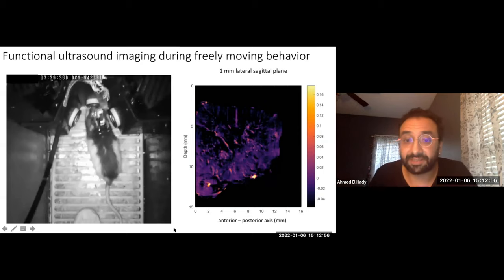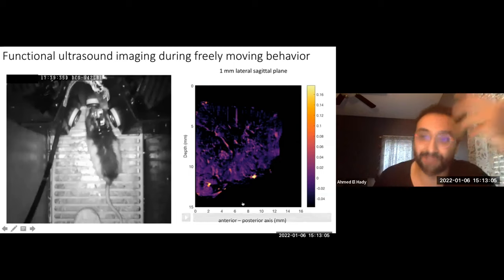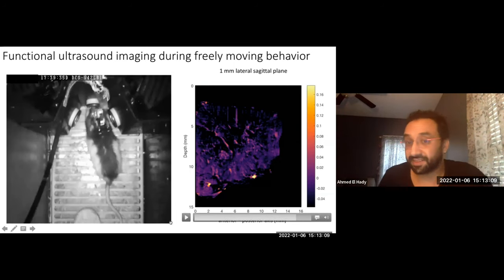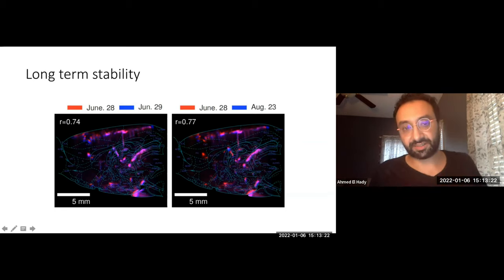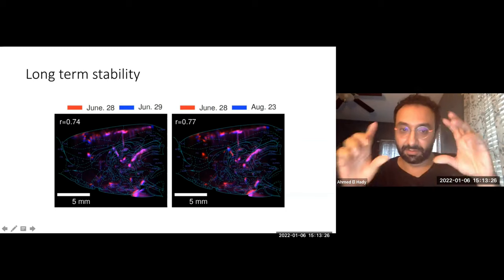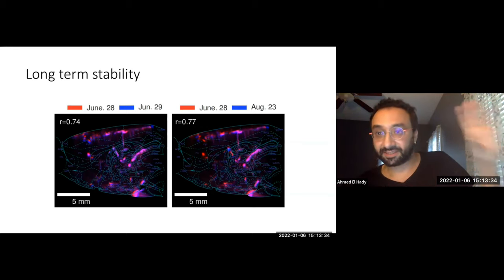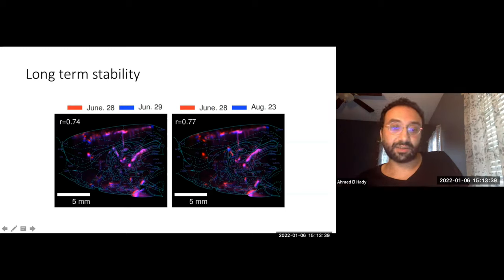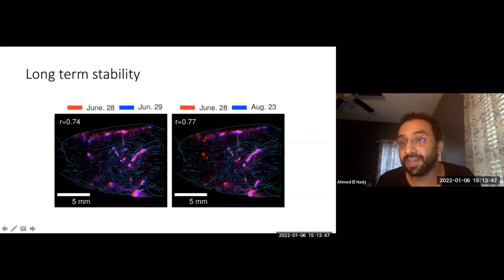This is stable in one session, but just to give you an idea, I trained these rats for 6 months and I would like to keep using them, not only for one session but for months. So looking at the long-term stability in these rats, I'm comparing here by overlapping the anatomical landmarks. Needless to say, the atlases I'm showing here are aligned to our own Princeton standardized rat brain atlas. Between 2 days, we get quite a good overlap; you can see it here in the blue and red. Even after 2 months, we can keep recording from the same animal, and we have a procedure to protect the craniotomy over this very long time.